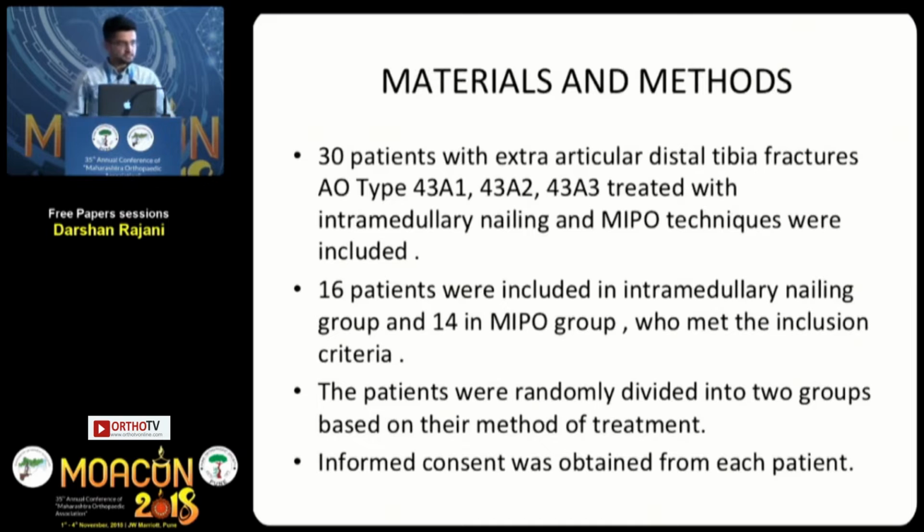Materials and methods. 30 patients with extra-articular distal tibia fractures, AO type 43A1, A2, A3, treated with intramedullary nailing and plating techniques were included in the study. 16 of them were in the intramedullary group and 14 in the plating group, who met the inclusion criteria. Patients were randomly divided into two groups based on their method of treatment. Informed consent was taken from each patient.